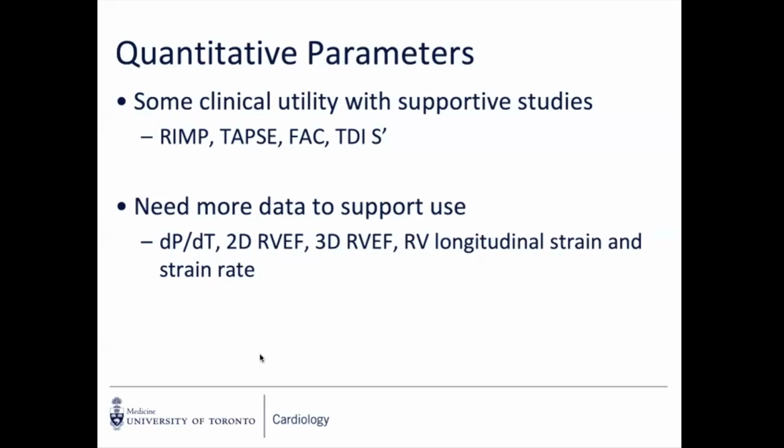A true 3D RV assessment, if it's good quality, is accurate. That would take everything out of the equation, right? That's the ideal, right? But obviously, they're still struggling a bit with the LV 3D quantification. So the RV is going to have to wait.